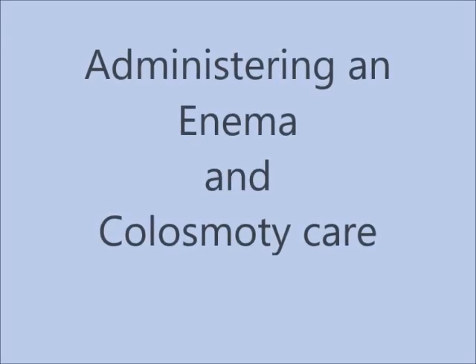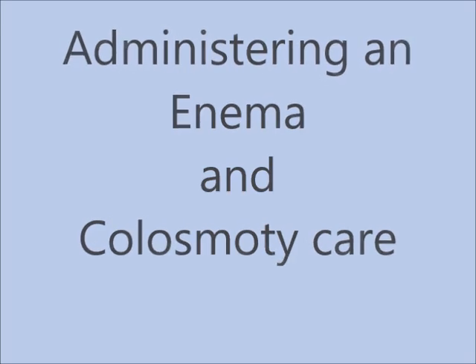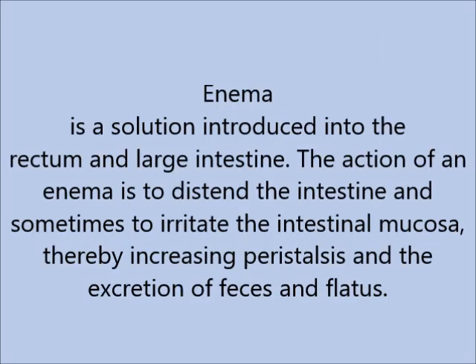Hello, this video will show how to administer an enema and how to perform colostomy care. An enema is a solution introduced into the rectum and large intestine. The action of an enema is to distend the intestine and sometimes irritate the intestinal mucosa, thereby increasing peristalsis and the excretion of feces and flatus.